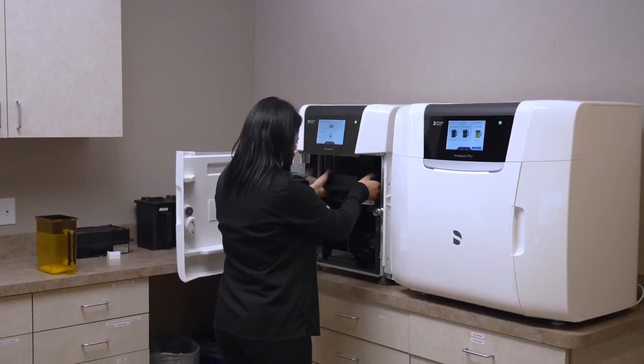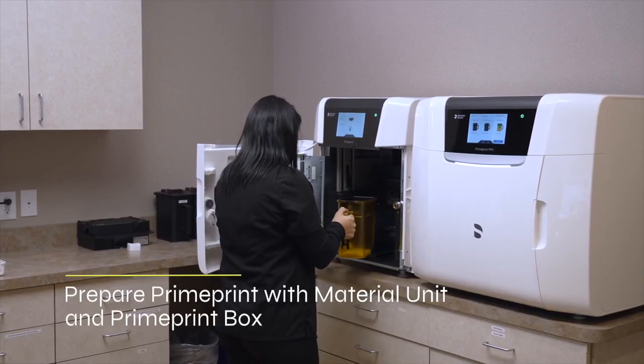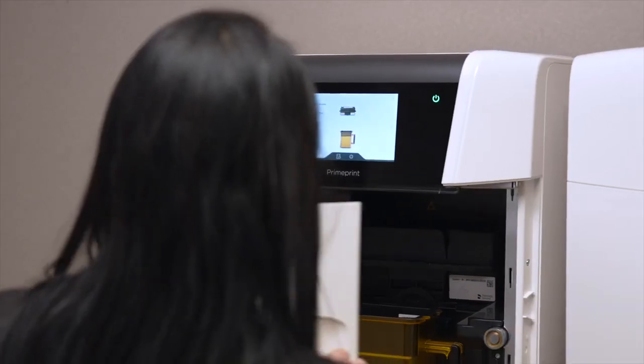Before we start the printing process, we need to prepare the PrimePrint unit and insert the correct guide resin for this particular indication. After she has the correct resin in, she'll reinsert the PrimePrint box and now we can start the printing process.